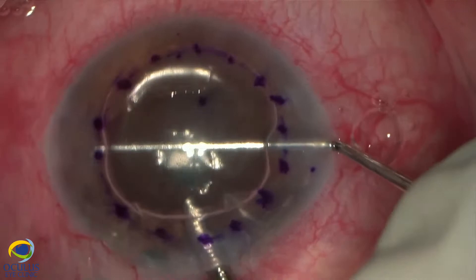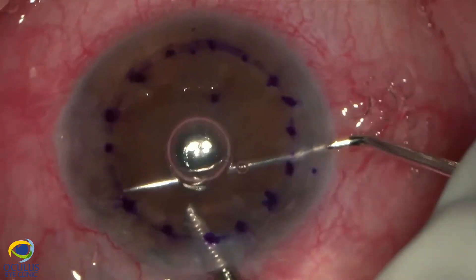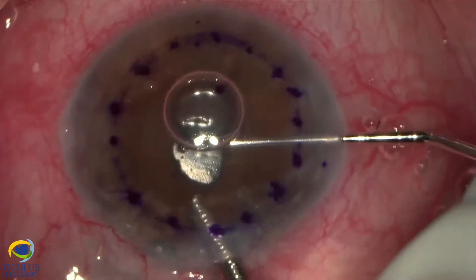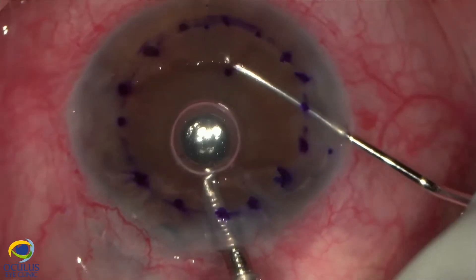Now the angle is completely open. We proceed to the next step: under air, we begin performing the descemetorhexis using a reverse Sinsky hook.